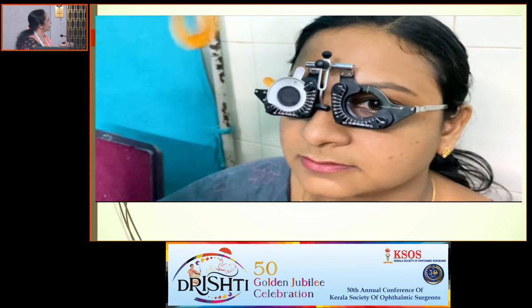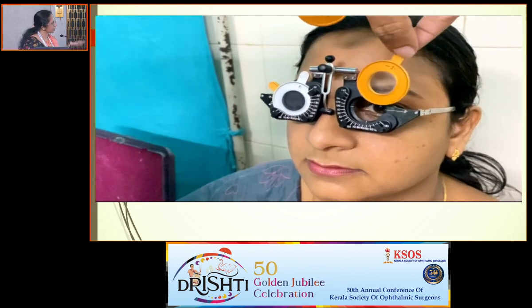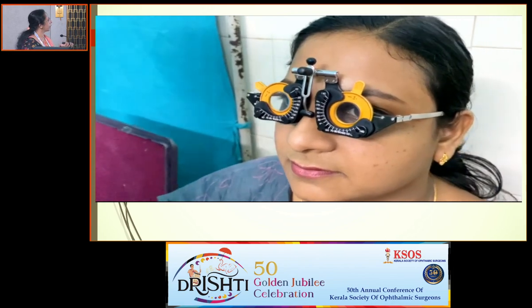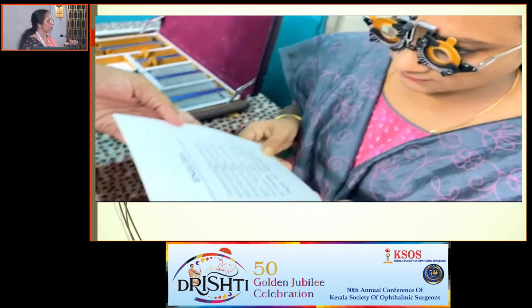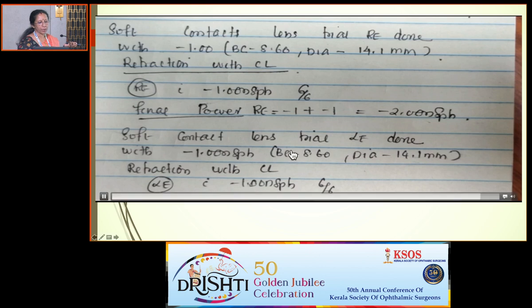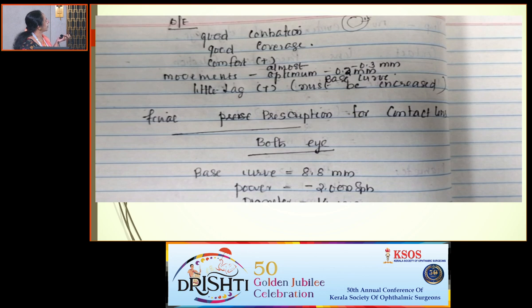Now this is the over refraction being done, because it was a trial lens of -1 diopter and the refraction was -2. If it is the same power, you don't have to do an over refraction, but here the over refraction with the -1 contact lens is -1. And this is the final prescription which has to go. There is good centration, good coverage, the patient is comfortable, with optimum movement. Since there is a little more lag, the base curve has to be increased. The final prescription should be given when you are dispensing the contact lens.